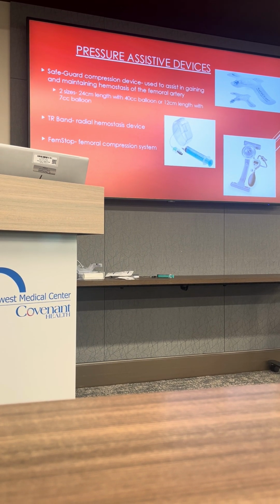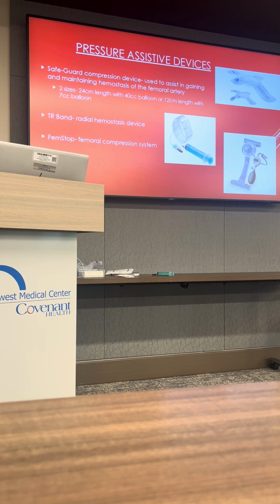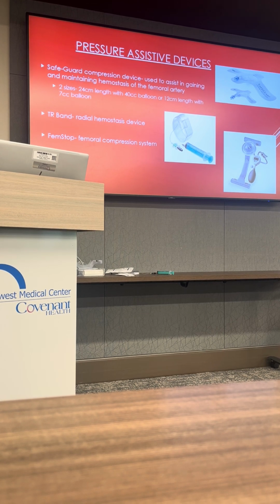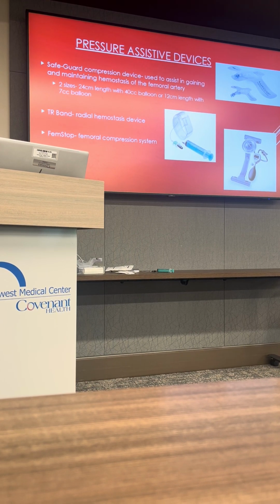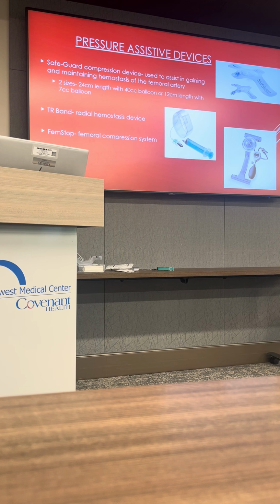Does anyone have any questions or anything to add on these devices? I've seen, when I came to ICU on the floor, the patient's up in a chair, and they've left the safeguard on, sometimes with air and sometimes without air. Yeah, and it needs to come off. Everybody knows I'm a crazy dressing person, so always look at your dressings, put dressings on, don't just leave that on, inflated or deflated, and have the patient walking around with it on.